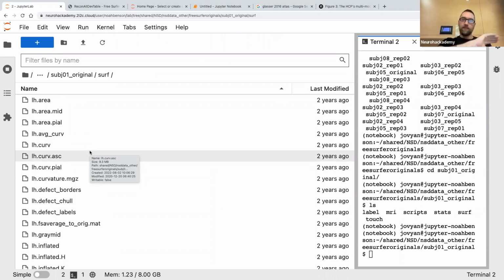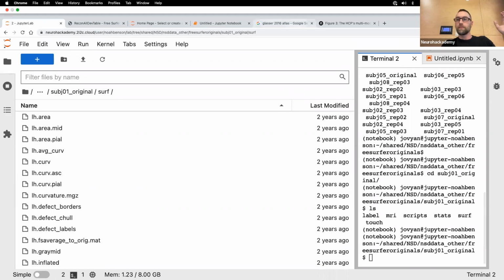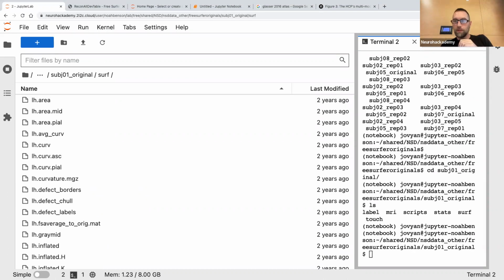Is that correct? Yeah. So the MGZ files typically do not contain vertices. All MGZ files contain are n-dimensional arrays. They're really just n-dimensional array files with a little bit of header data. Now that's kind of important, because sometimes we do store surface data in the MGZ files. Do I have a question from online? No one on Zoom asking a question. Okay. Yeah, sometimes we do store surface data in MGZ files, and I'll talk about that a little bit later here.